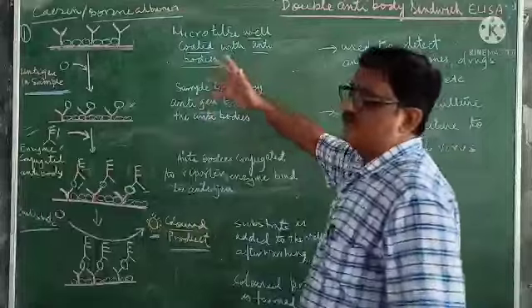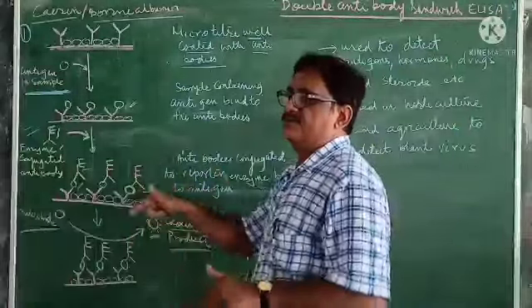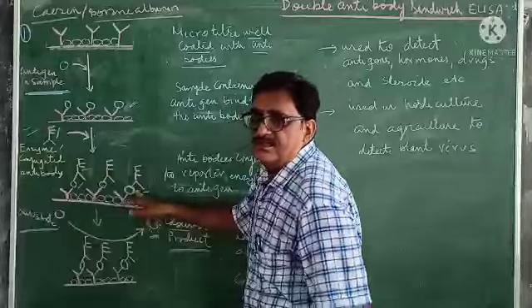Only antibodies bound to the surface, indirectly through the antigen, will remain.